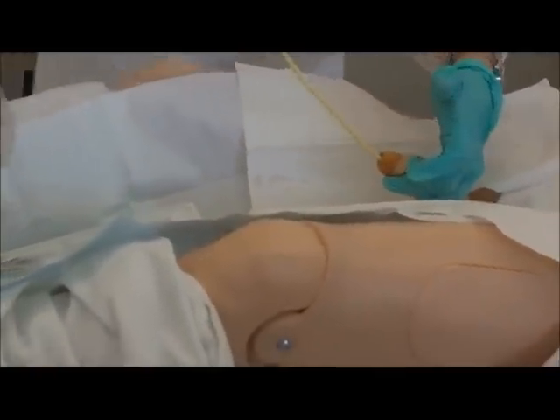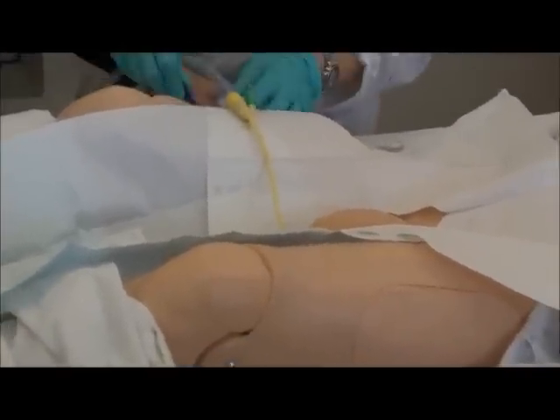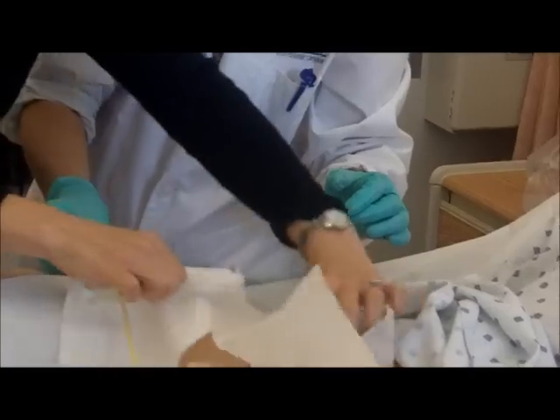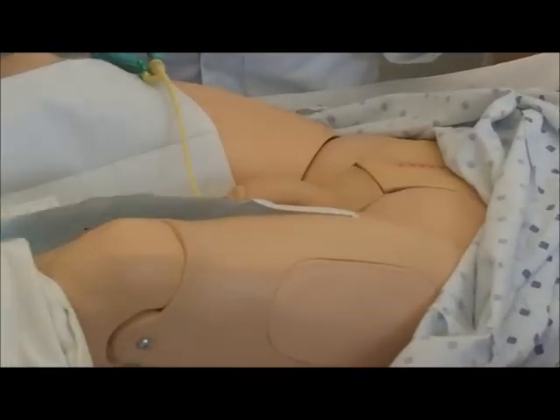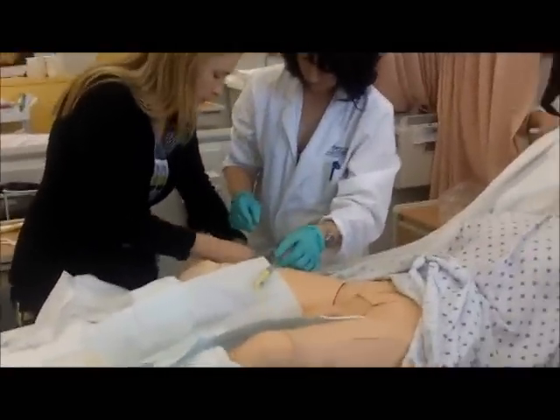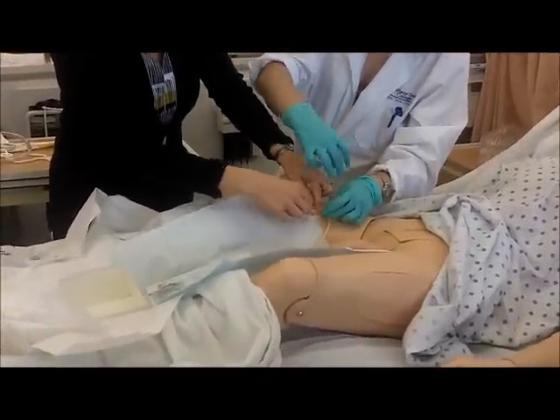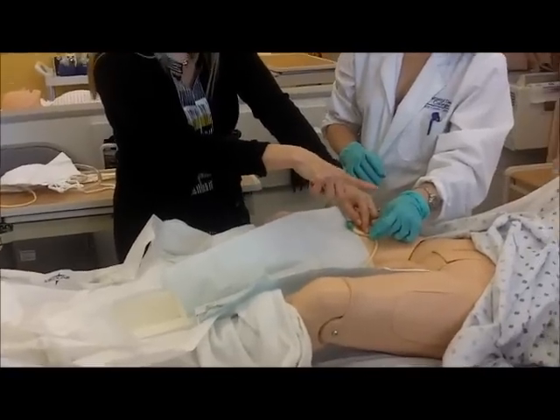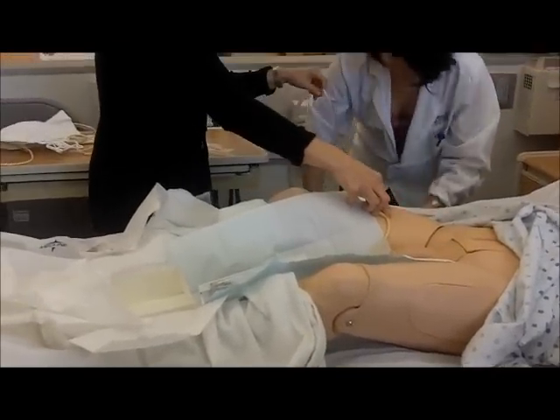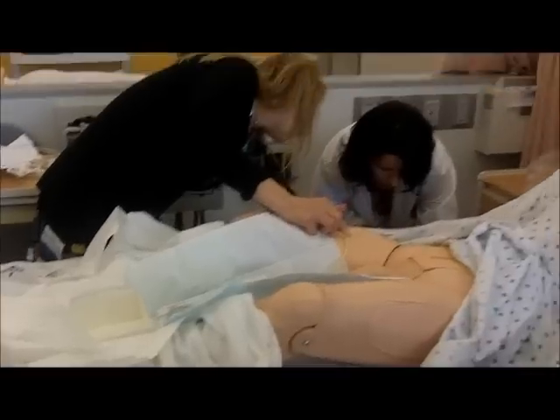So now you're going to tell me: I would go ahead and attach this to the patient's leg. I need to attach this to the patient's leg. This — let me clip it — I just clip it onto the sheet. Now normally when you're using a stat lock — I don't think we have any here — you normally would attach so that there's a little bit of slack. The lower lock actually kind of goes like this so that it lays like this. And you actually put benzoin — that ointment that dries, that little sticky ointment — you put that on first, and then you put your stat lock, and then you put your catheter here attached here. And then this doesn't go on the floor. Some of these have little hooks, some of them have strings.